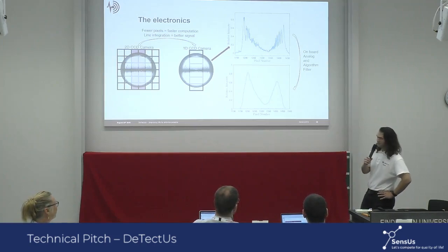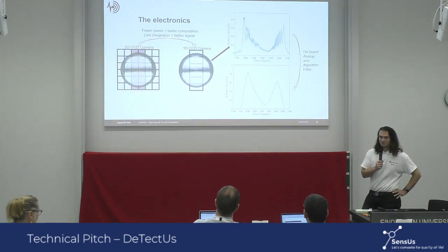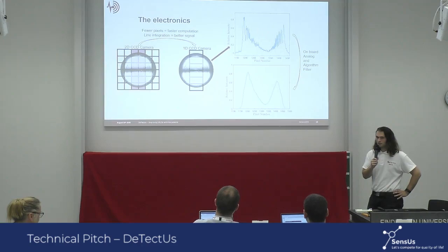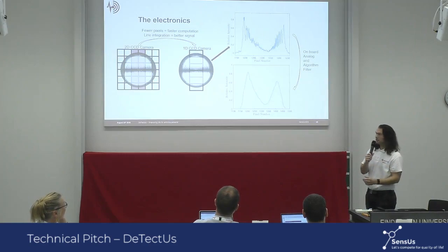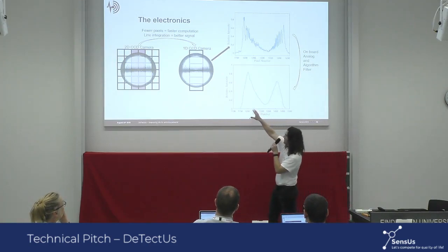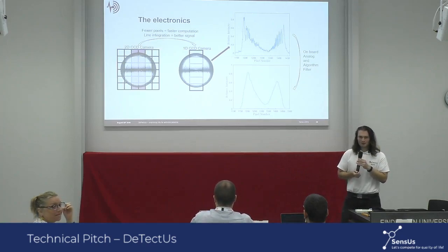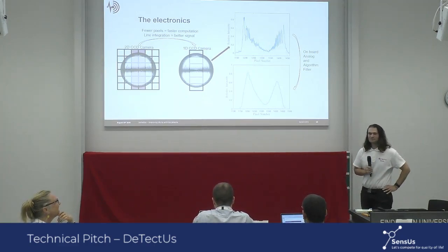So these are not to scale; they're much smaller in pixel line. So pixel density. So if I look at this picture, the width is not the width you normally measure. So I see now a bandwidth. So it's the height basically of the black band. So the picture is not the accurate, not the same result as you have. That's what you say. No, the round image, that's our signal. The round image. Yes, and also these ones. So the overlay of the pixels. Okay, so let us have a discussion afterwards. I don't understand it yet, but I hope I will later. Thank you very much for your presentation.